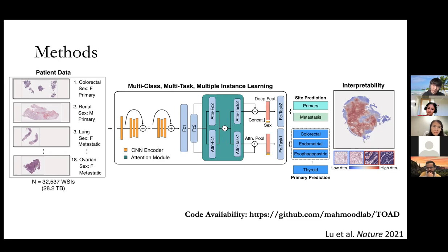The issue becomes, what if at test time you encounter a sample that just has the second type of morphology, right? Then your attention network might not have been trained to recognize it at all, in which case your classifier will most likely fail.